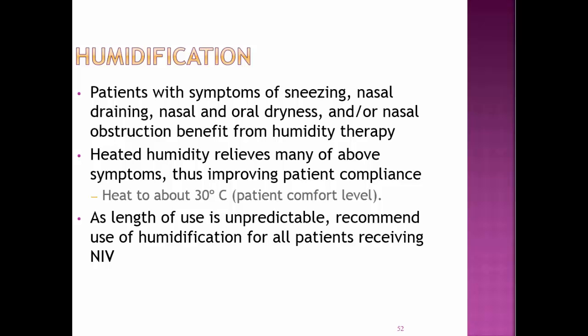As you're breathing, you're not really getting any pressure, and the flow from the ventilator just goes in the nose and out the mouth. And it will really dry your mouth out. In fact, it'll wake you up if you're asleep. It'll get so dry and uncomfortable. So adding some humidity, especially heated humidity, relieves many of these symptoms, thus improving patient compliance. Heat to about 30 degrees Celsius. Remember, you don't have to have it at 36 because you still have your nose in play there. So humidification is recommended for all patients receiving non-invasive ventilation.